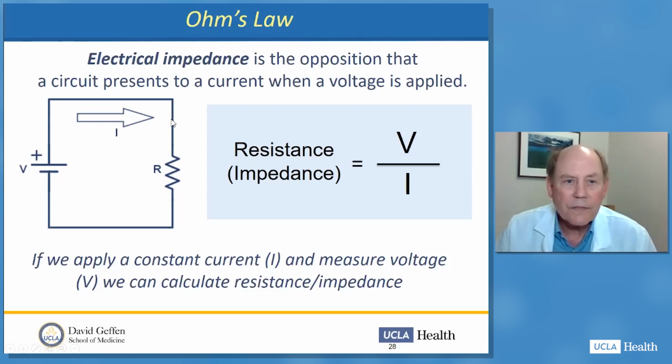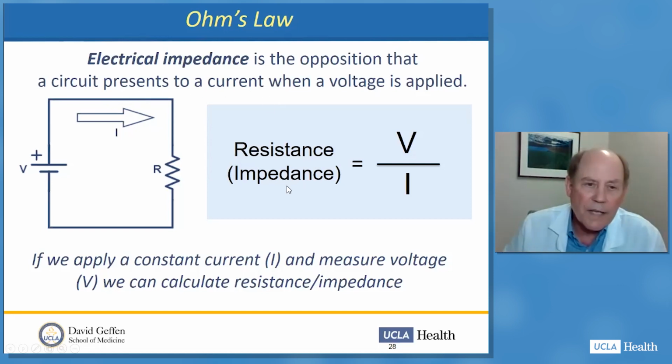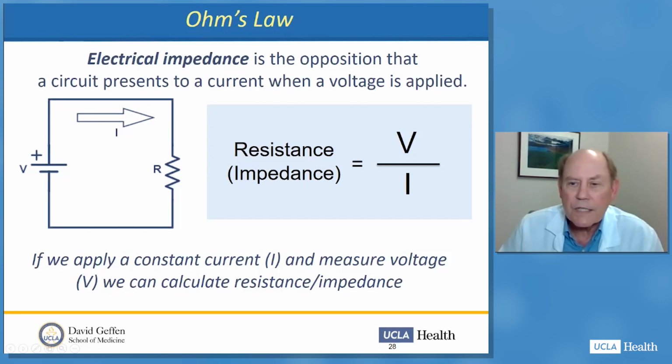All right, back to Ohm's law. Remember, electrical impedance is the opposition that a circuit presents to a current when a voltage is applied. Here's our simple circuit with the voltage, the current, and a resistance. And remember that resistance or impedance can be calculated from the voltage and the current in the circuit. So in this case, if we hold the current constant and measure voltage, we can calculate then impedance or resistance.